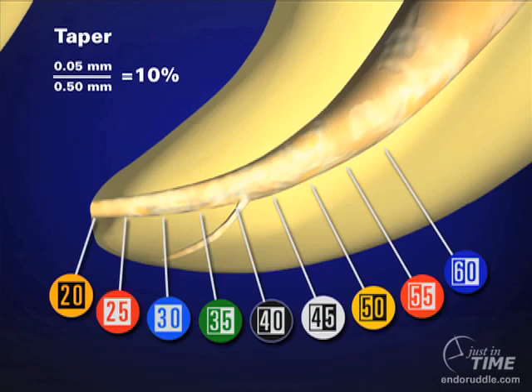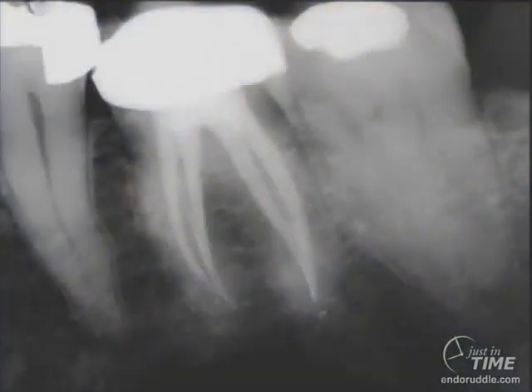If you look at the postoperative film of the tooth we just looked at clinically, you can see the mesial systems are well shaped. There's an anastomosing between those systems and there's a little bifidity apically. The endodontics is simple. It's not so complicated, but it goes to show that ProTaper can use 3 instruments to give you these kinds of shapes, and well-shaped canals allow for dynamic irrigation, and dynamic irrigation cleans into the inaccessible areas of the root canal system so we can fill root canal systems with warm gutta percha and sealer.